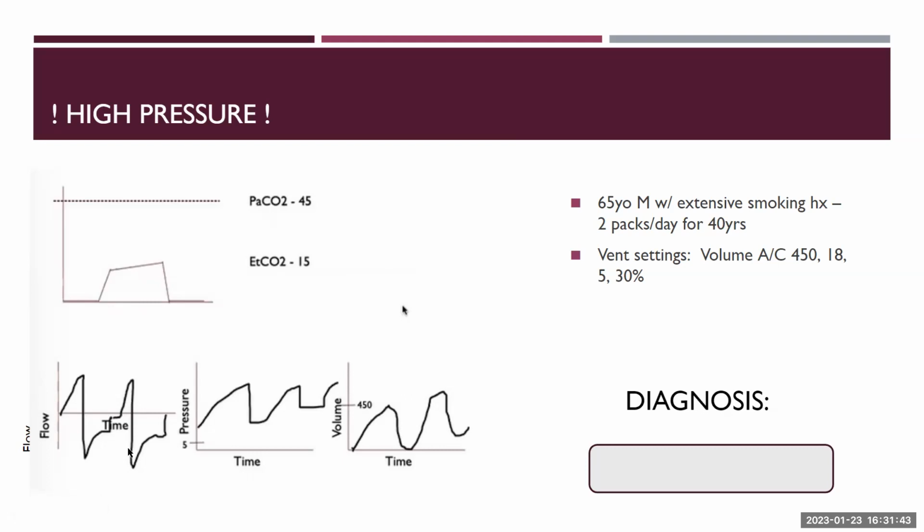And the pressure and volume curve is a little funky because it keeps climbing up. So I'm not sure, but it seems like they're inspiring before they finish expiring, and they're retaining more volume.